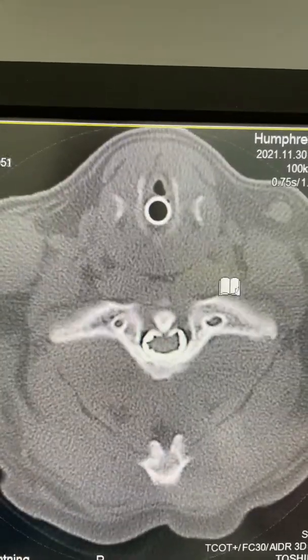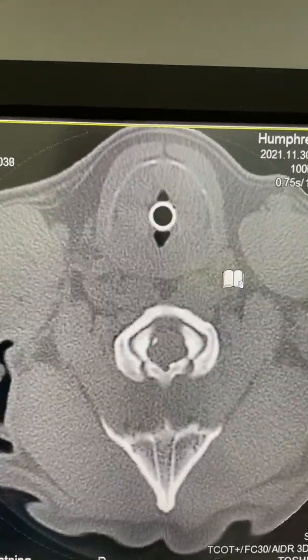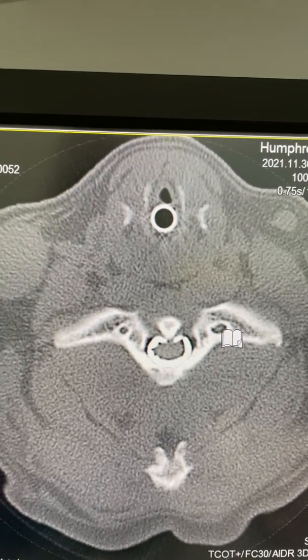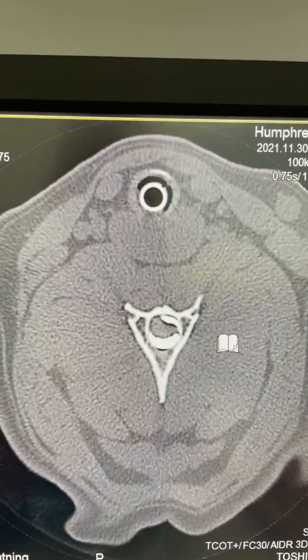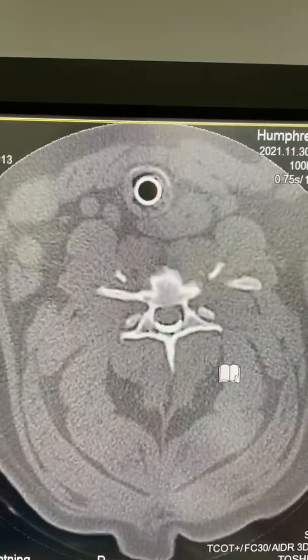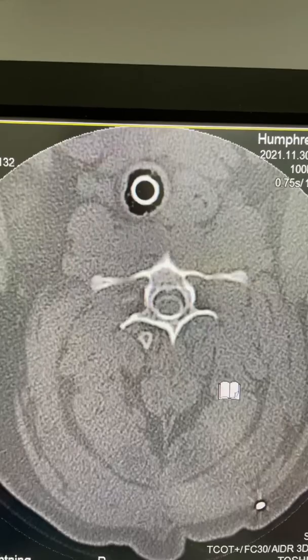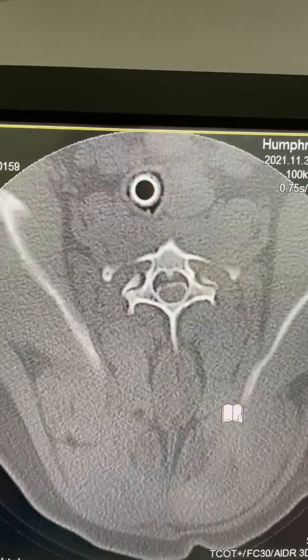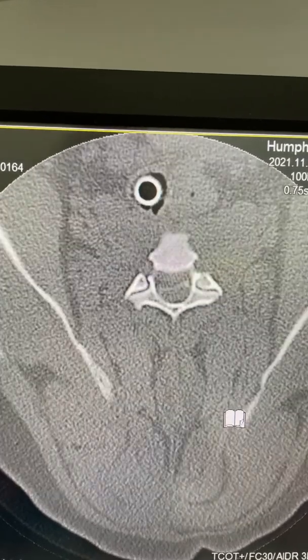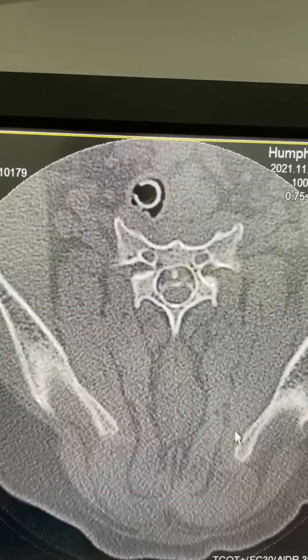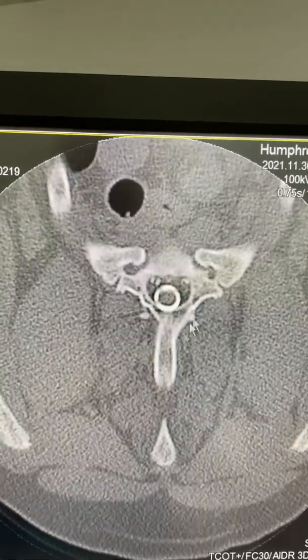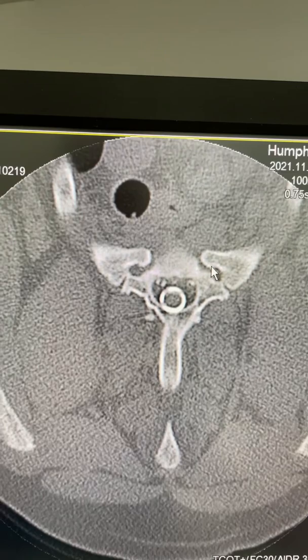Just to review, we'll go all the way back to the other end. We have the foramen magnum here, C1, start seeing myelographic contrast there, then head back into C2 which has that classic triangular shape. C3, 4, 5 — and then at C5-6 we have compression of the spinal cord right there. That's C6 with very prominent transverse processes, then C7, and then T1 with the first ribs — the thoracic vertebra with the first ribs.